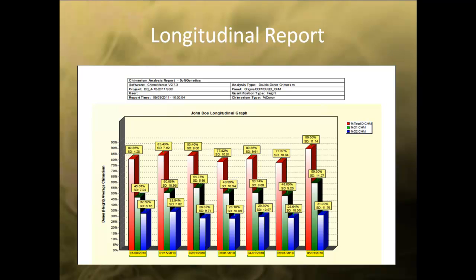Once you have reviewed the project and saved it, you can use the longitudinal report to build a graph using all the samples present in the project. The graph shows deconvoluted donor 1, donor 2, and total donor chimerism. Using this graph, you can see the fluctuations between donor 1 and donor 2 as time goes on. Please review the Learn-to-Know webinar for more detailed information on this report.